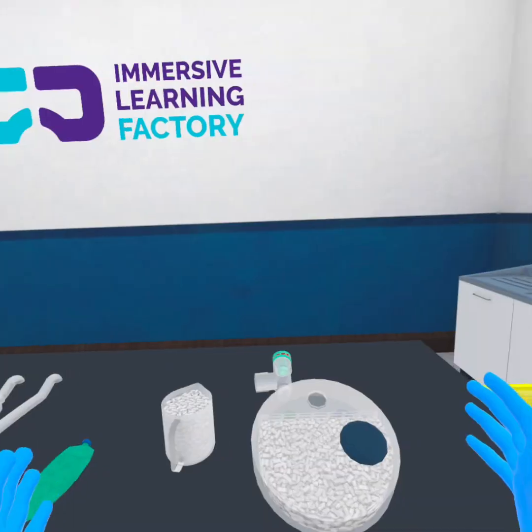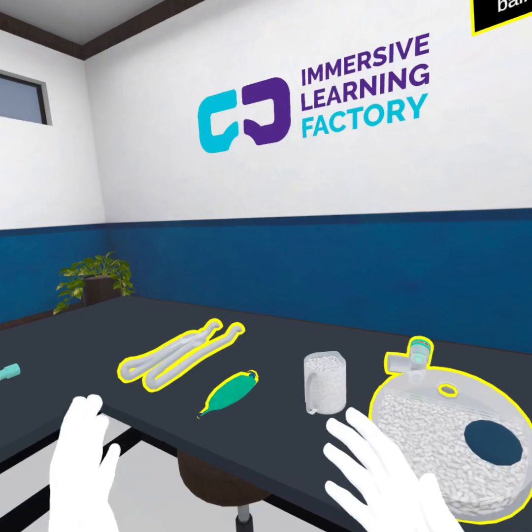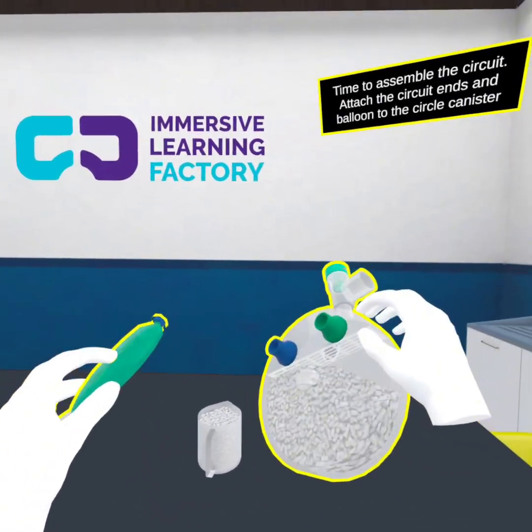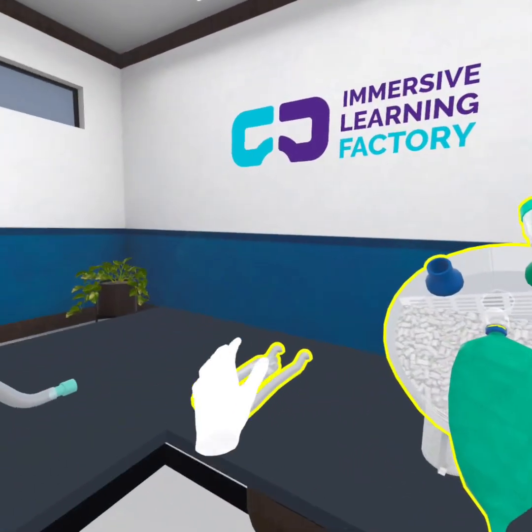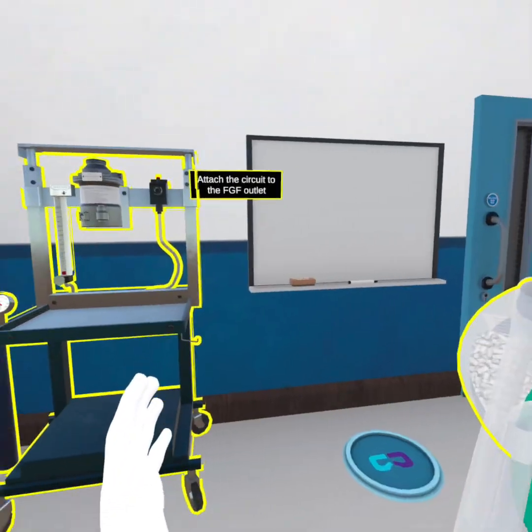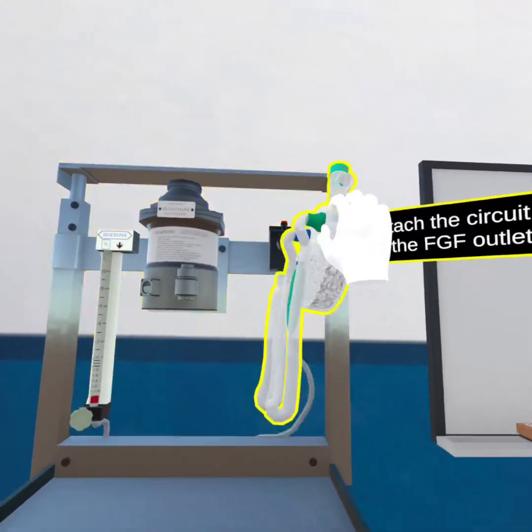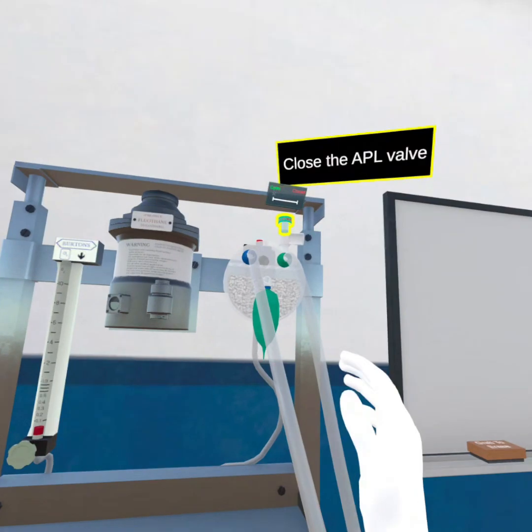Touch the clinical waste bin to remove all PPE. Time to assemble the circuit. Attach the circuit ends and balloon to the circle canister. Attach the circuit to the FGF outlet. Close the APL valve.